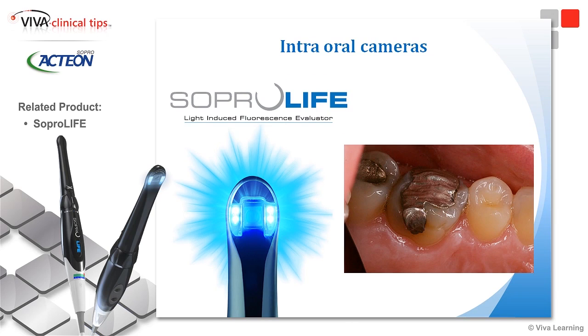So intraoral cameras are a big piece of what I do also. And the reason is that it isn't convenient in the middle of a procedure to strip off my gloves, get out retractors and mirrors, and start taking photographs. Well, that's fine if I'm really looking to document the case because I'm going to either give a lecture or write an article, but on day-to-day stuff, why?